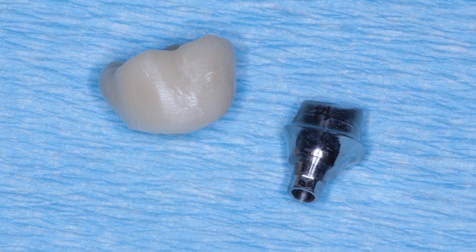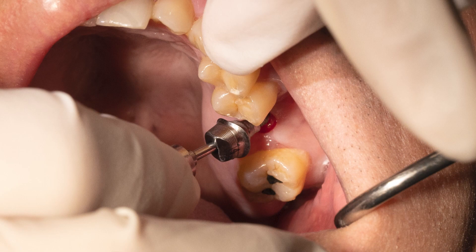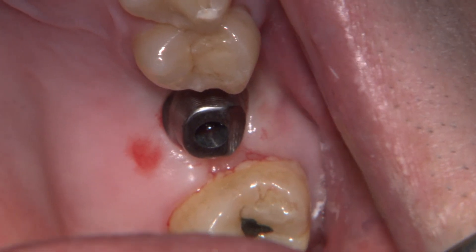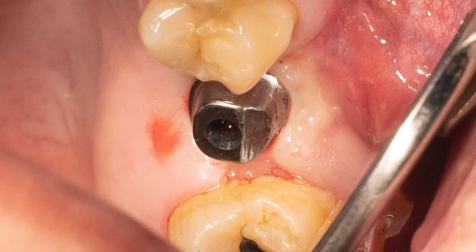To scan a custom abutment, seat and tighten the abutment to the recommended specs and verify complete seating with a radiograph. In some cases, soft tissue recontouring may be necessary to provide room for the abutment to seat properly.